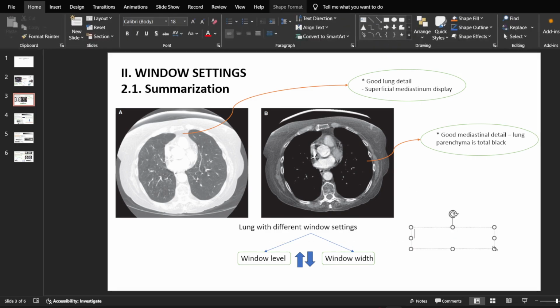You have raw data. From this point, a Hounsfield unit is attached. It's a label, labeled for each pixel in your picture. And from this point, you get a gray point on the gray scale, labeled for each pixel.